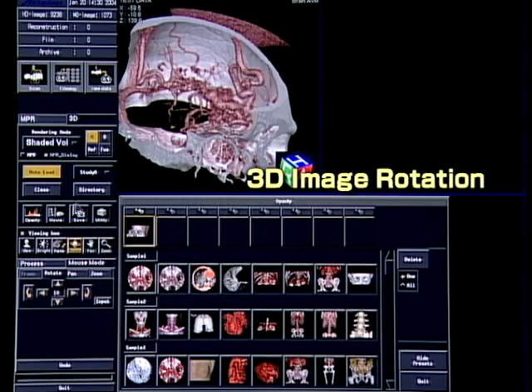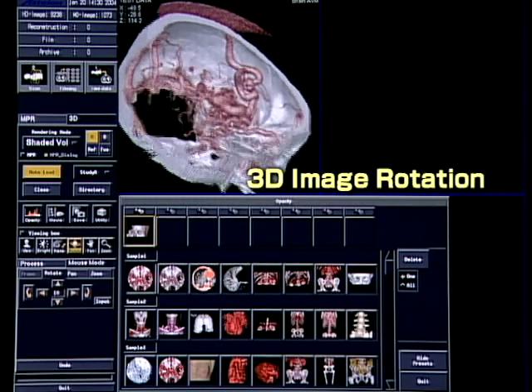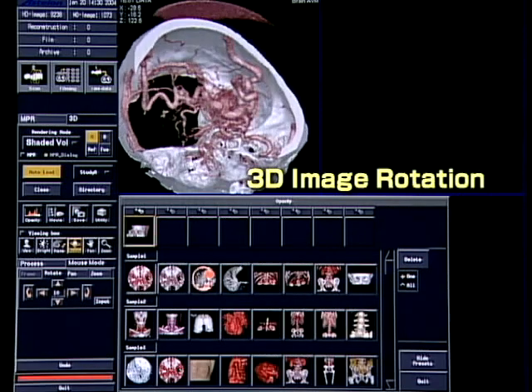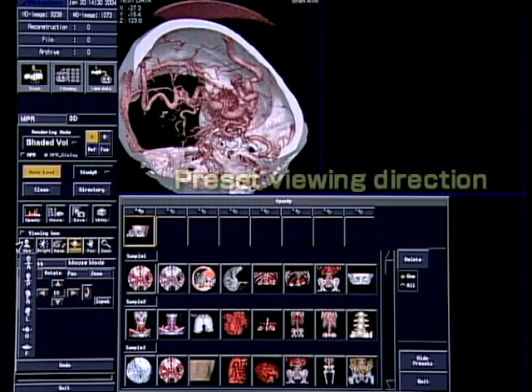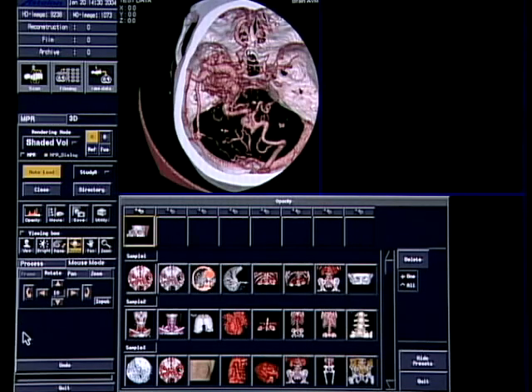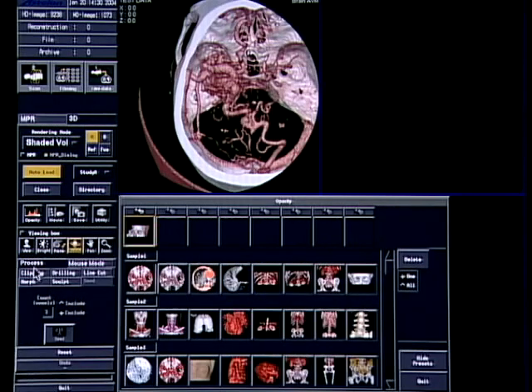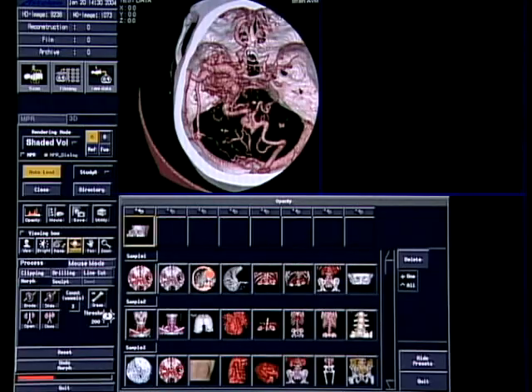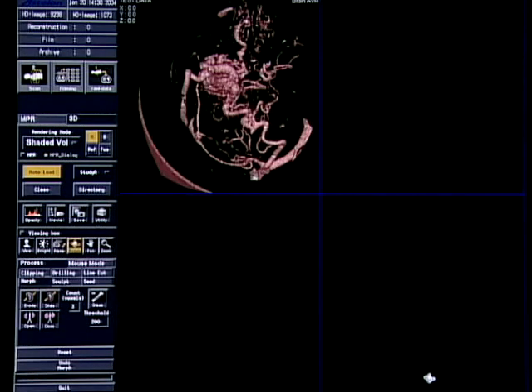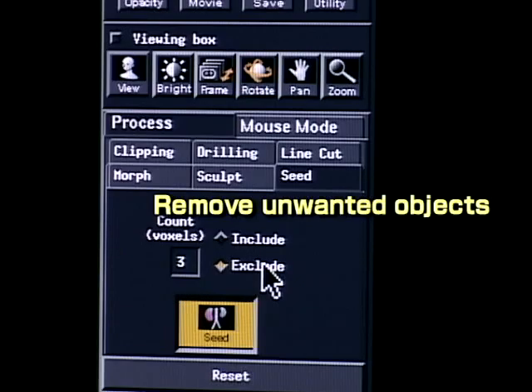Only the corresponding pictogram has to be selected. It is possible to rotate the image by specifying the viewing direction. Alternatively, the image can be directly rotated by dragging it. Bones can be eliminated from here. Unnecessary parts of the images can be eliminated by easy operation.